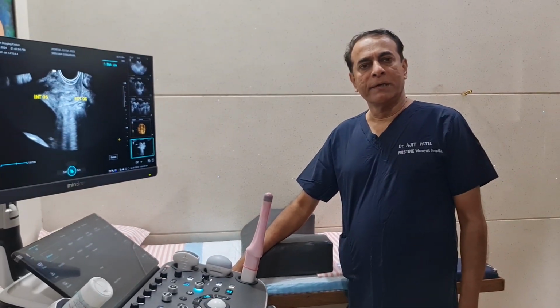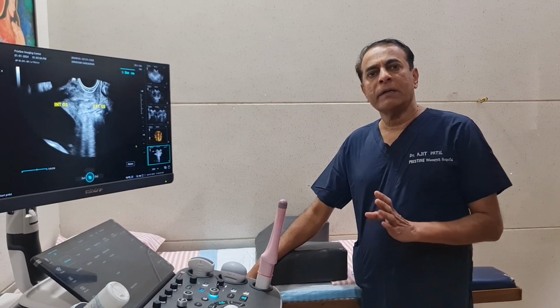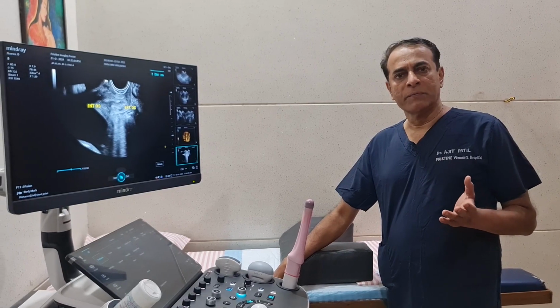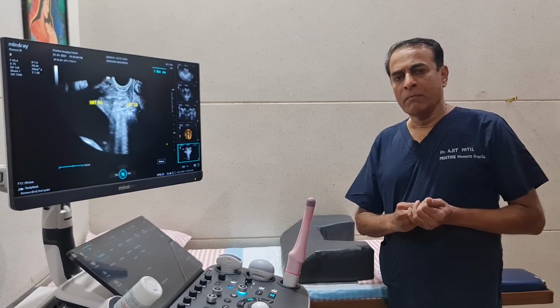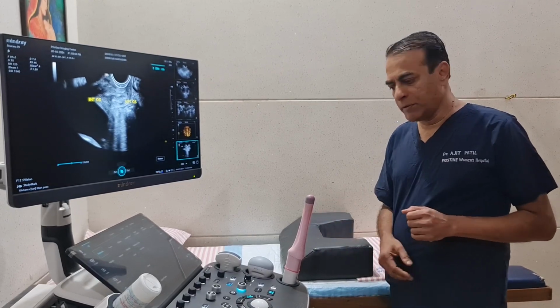Small presentation, let us see how to measure cervical length transvaginally. Cervical length is the only direct way of assessing the patient's risk for a spontaneous preterm birth, while the rest of other things like history and other factors are surrogate markers. But before we learn how to measure cervical length, let us look at some of the basics.